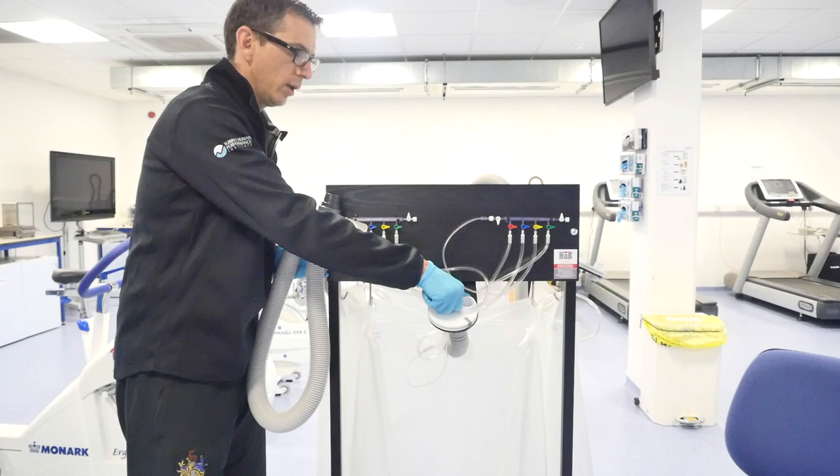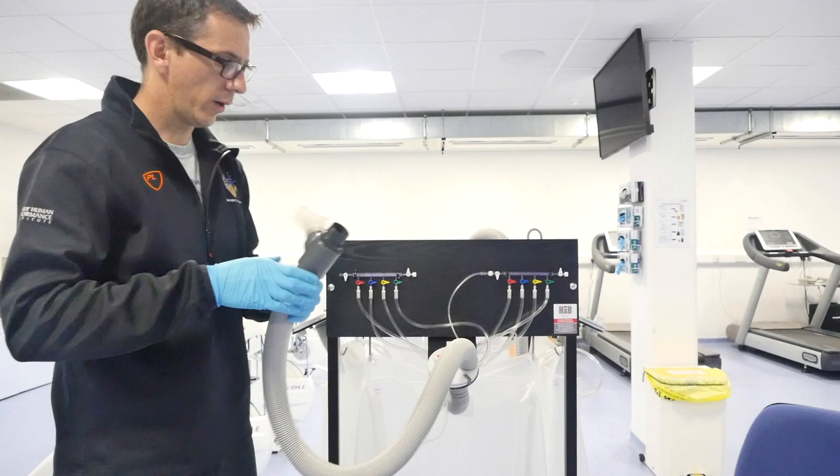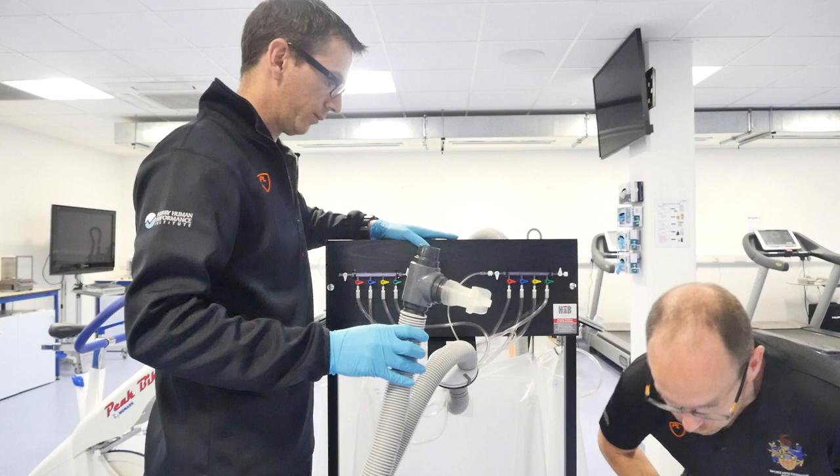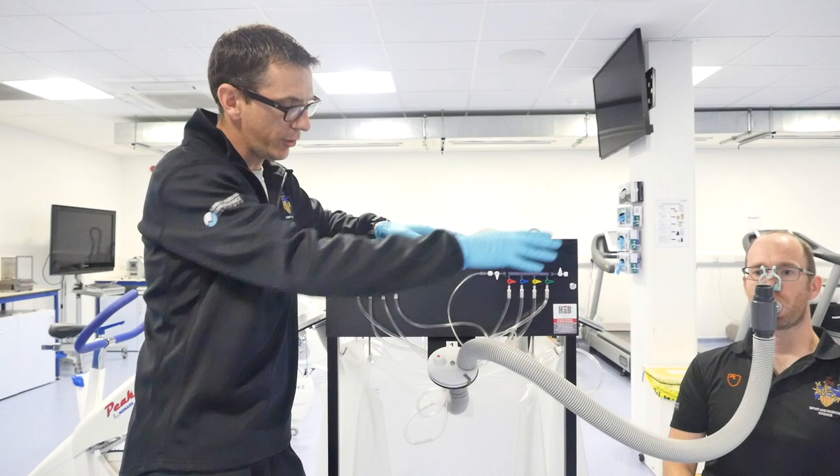I'm going to connect this on securely here. Now I'm ready to pass this to my participant. The participant's got the mouthpiece in, got the nose clip on, and currently they're just breathing with the gas coming out into the atmosphere, so we're not collecting any gas currently.